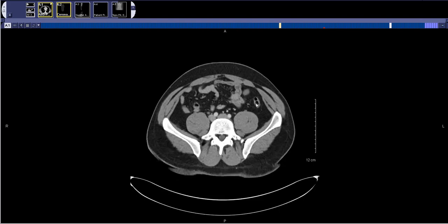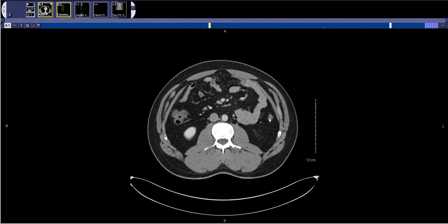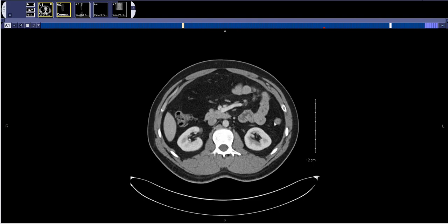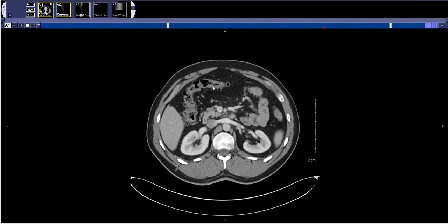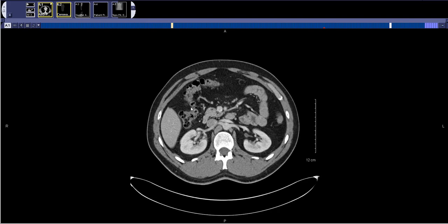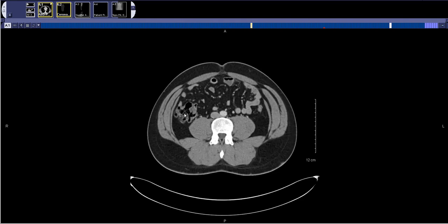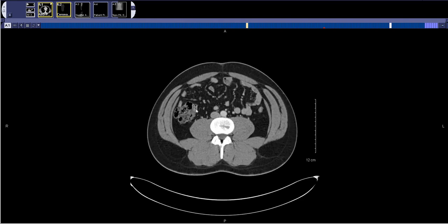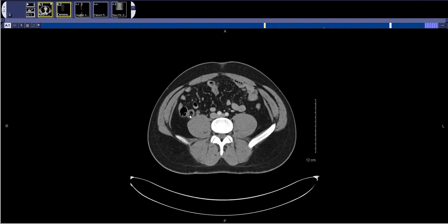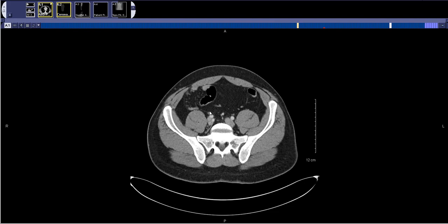But after finding that, I keep following the colon up — all the way up to the splenic flexure, then across through the transverse colon, hepatic flexure, down to the cecum. Right here is the ileocecal valve coming into the colon. Below the ileocecal valve is where you will see the appendix come off — and there is the appendix right there.